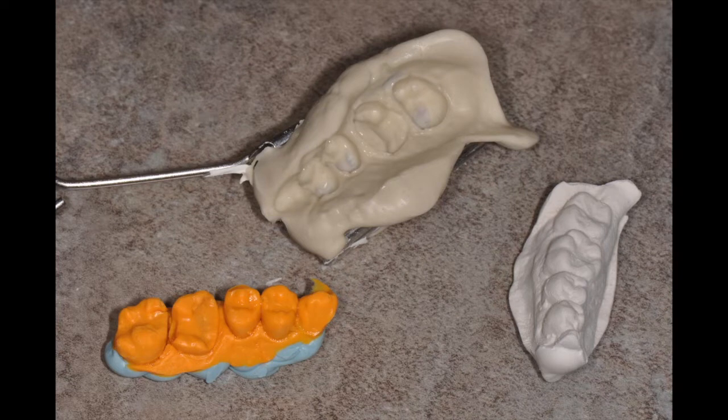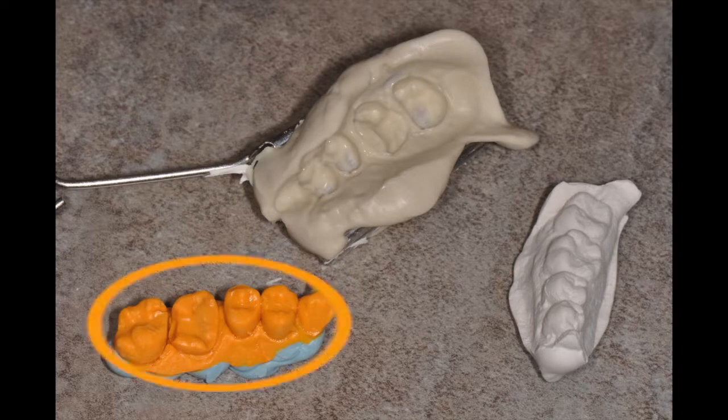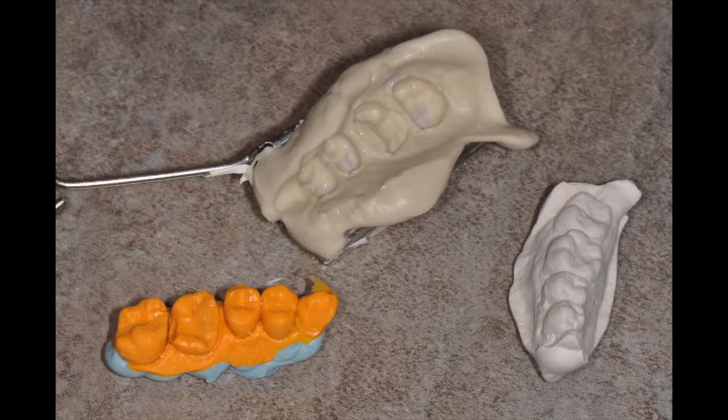Once the prep is completed and sealed, the rubber dam is removed and an alginate impression is made with the triple tray. To record accurate margins, a Monoject syringe was used to deliver alginate around the preparation margins. The preparation side of the impression is immediately poured to prevent distortion using a light body polyvinyl siloxane impression material. This will create an accurate, flexible, and workable model on which the composite onlay will be made.